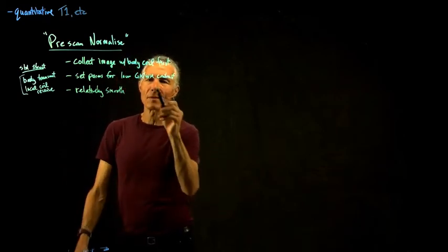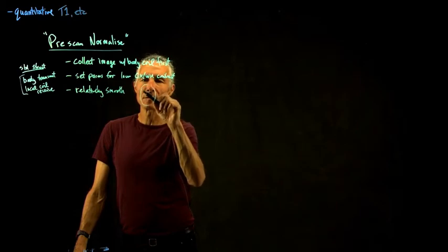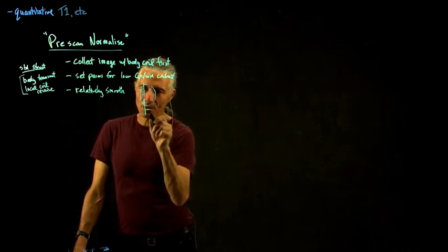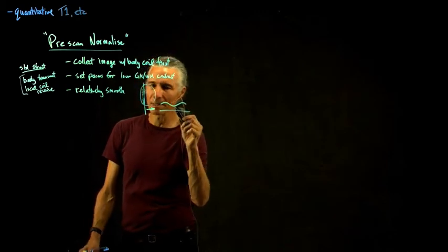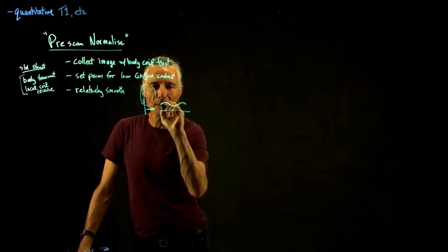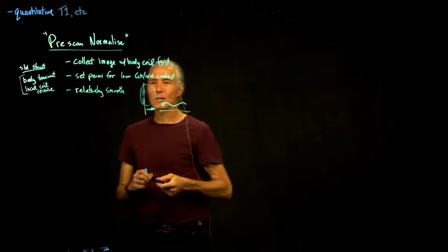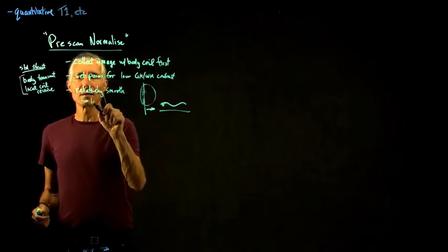So what that means is if you look across the head, there's going to be variation. So this part will be a little brighter over here because it's next to the coil, and then it gets a little darker, and then this part gets a little brighter. So if you plot the field through there, you're going to get relatively smooth variations. It won't do something like that and then change. So because it's relatively smooth, you can collect a low res scan.